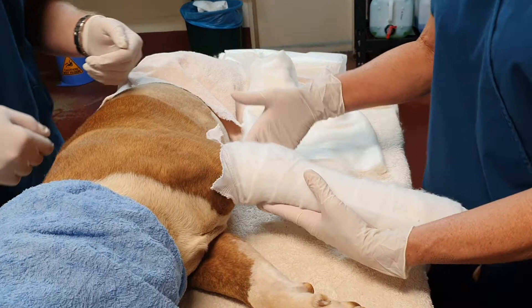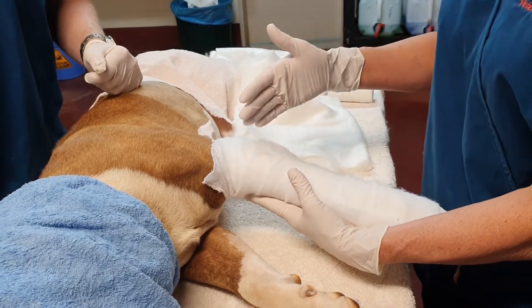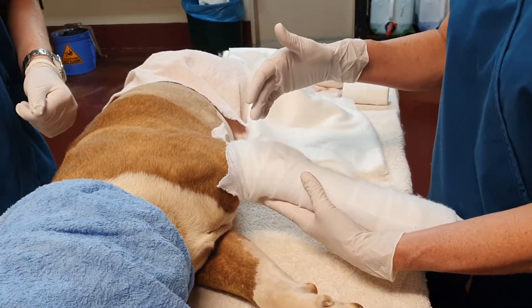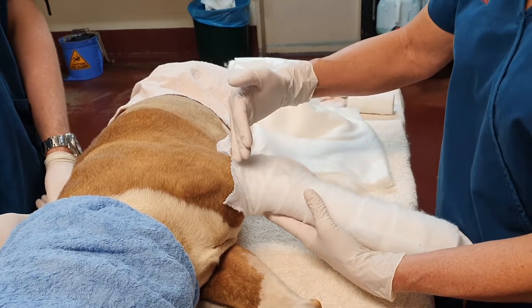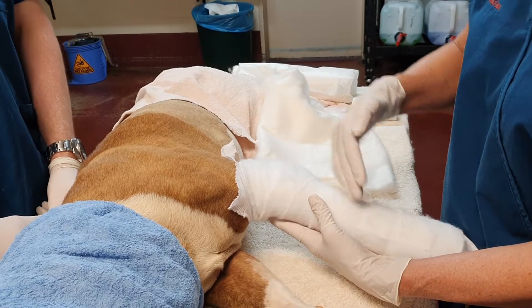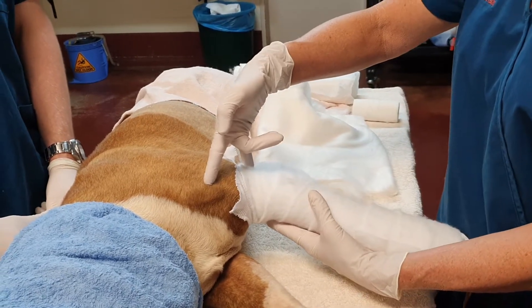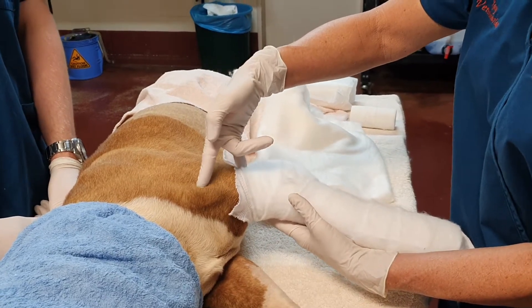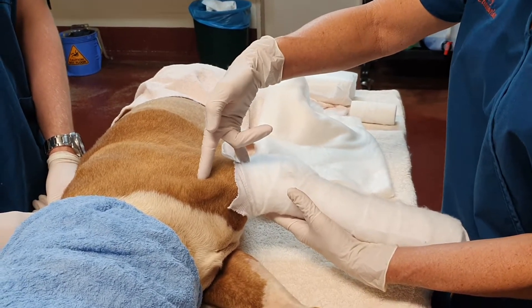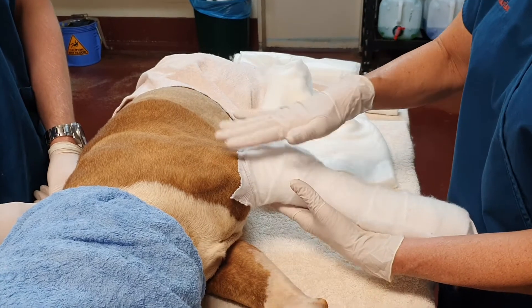When do we use a spica splint? We use a spica splint if we want to apply some stabilisation above the elbow. A lateral splint has to be below the elbow, but if we have a fractured humerus in a very young animal that we want to treat with external coaptation, we have managed those with a spica splint.